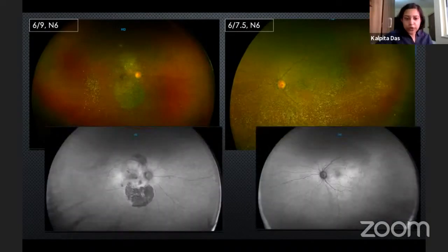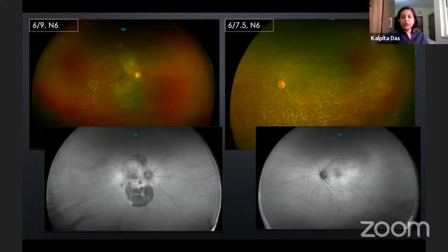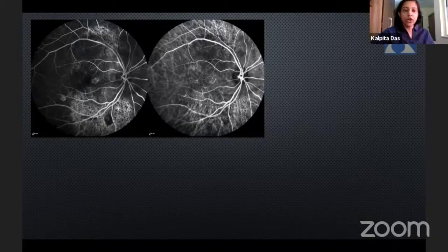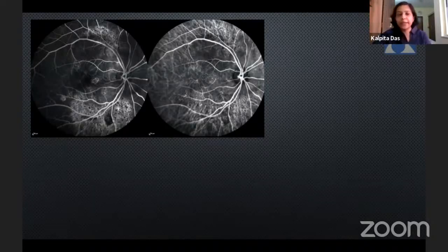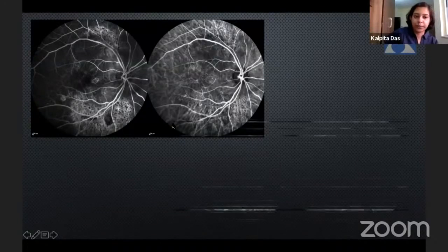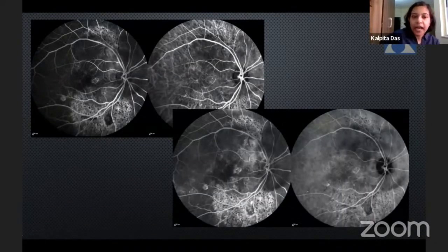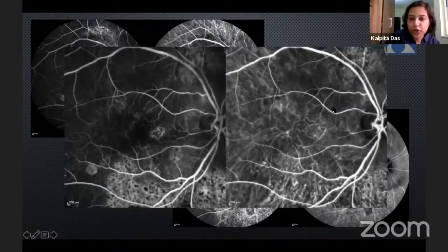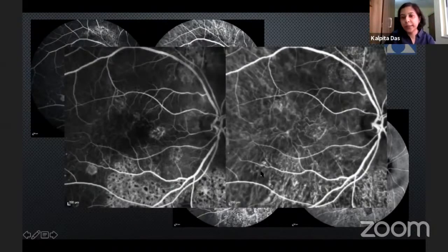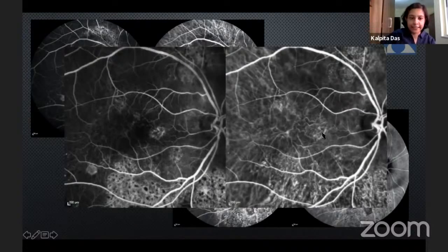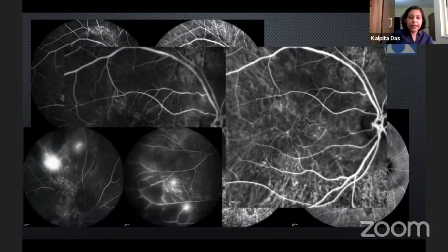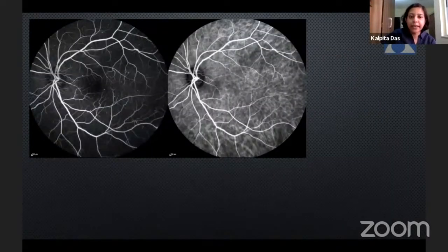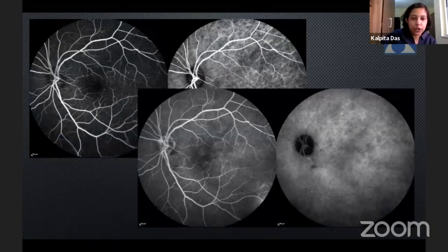On autofluorescence, the area of RPE atrophy was more prominent. FFA-ICG in this visit showed a typical pattern of leopard skin appearance corresponding to the area of RPE atrophy, which was more prominent in the late phase. Looking carefully at the macula, there was also presence of a choroidal neovascular membrane and a very large network of BVN at the macula on ICG in the late phase. At the same time, the patient developed PDR changes in the right eye. The left eye maintained NPDR changes with no other significant findings.